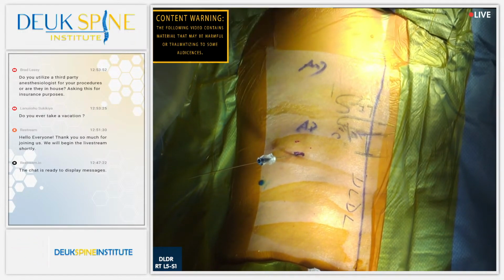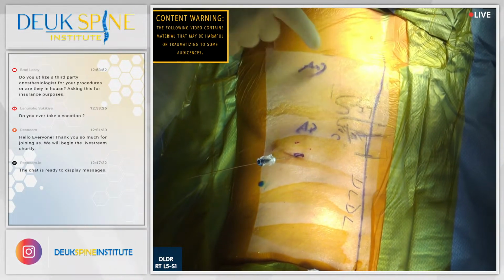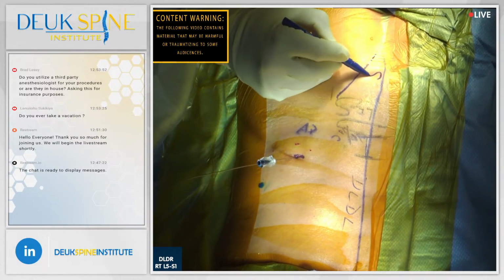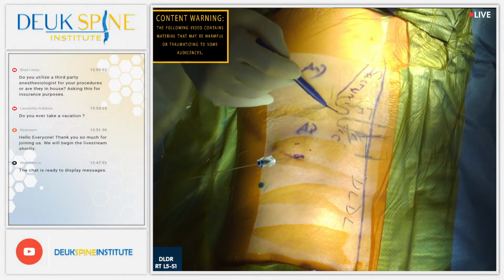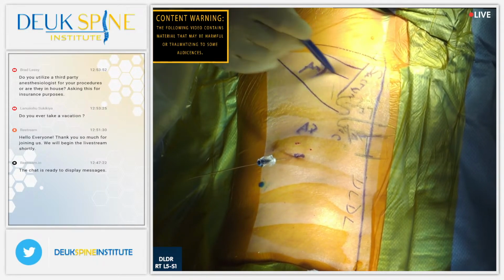When we're finished repairing the disc, we're going to turn our attention to his piriformis muscle. He's got a tear in the muscle. The muscle attaches from the sacrum or tailbone. It's a bone, sacrum. It attaches from the tailbone and runs down to the hip, all right? This is the piriformis.